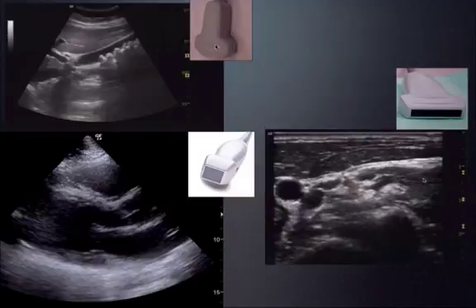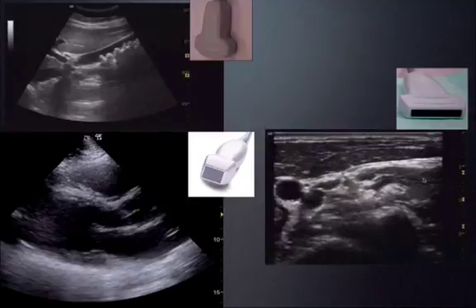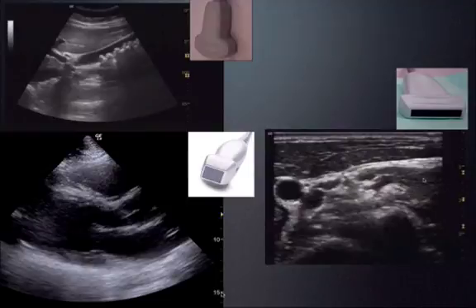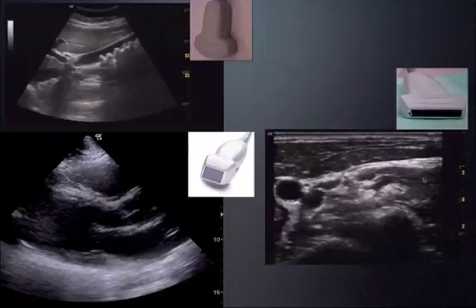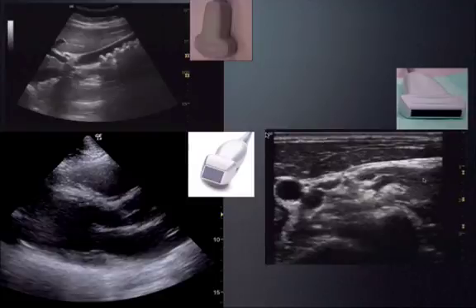Looking at examples: the abdominal probe shows a curved footprint with deep penetration — well over 15 centimeters. The cardiac probe's sound waves originate from one focal point and fan out similarly, also reaching over 15 centimeters because both are low frequency probes. The linear probe shows much nicer resolution — you can clearly see muscle tissue and vessels — but only about four centimeters of depth. You can also see the linear footprint on screen.